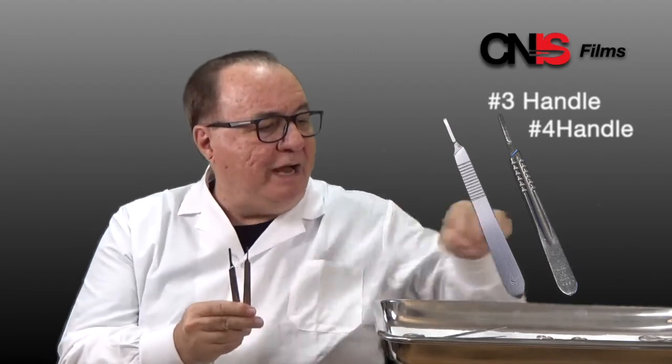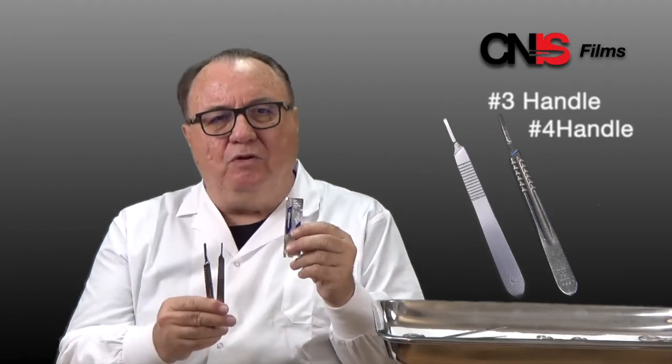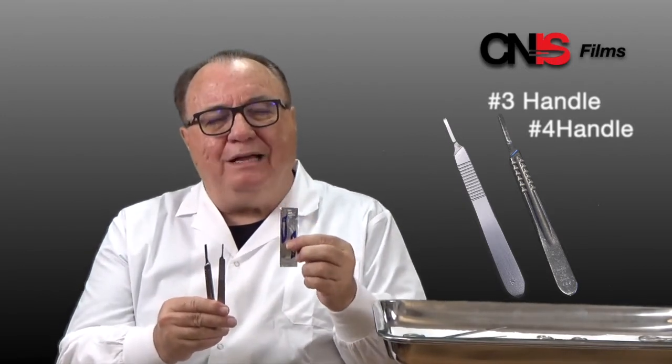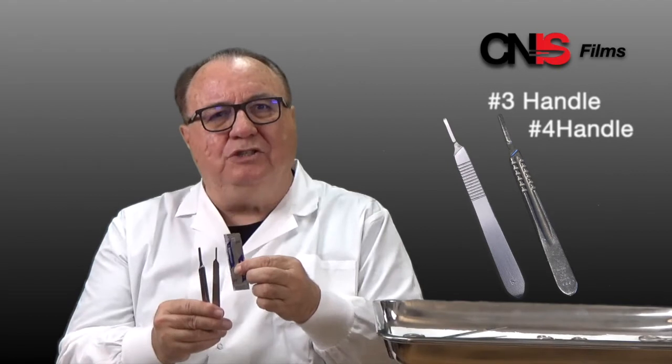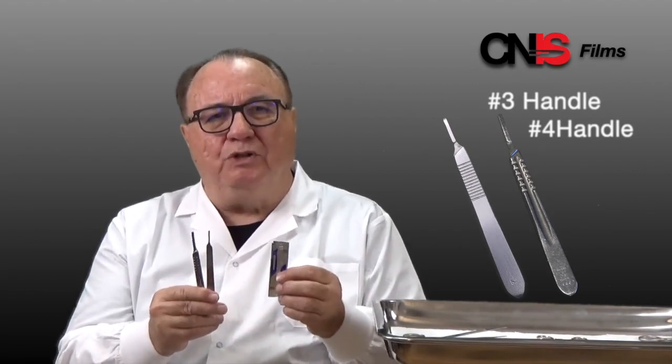Minor surgery will often involve the use of a scalpel. There is the number three handle and the number four handle for scalpels. You attach blades to the scalpel. We'll show you how to do this in an upcoming video, but you add different scalpel sizes and different blade sizes depending on the procedure and what you need to do.